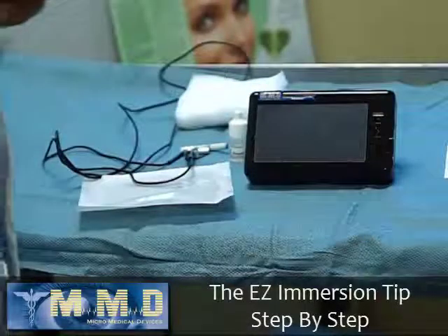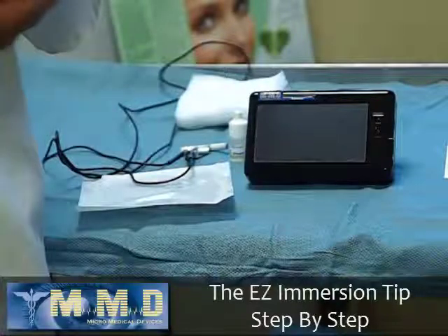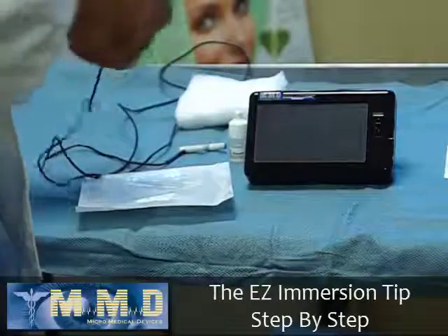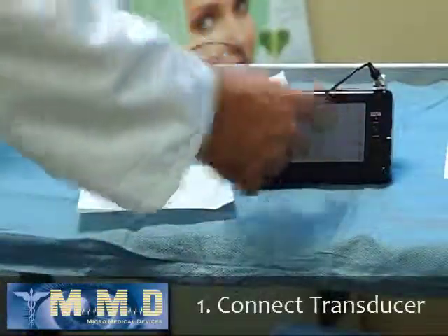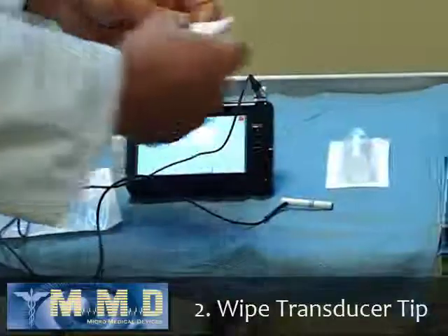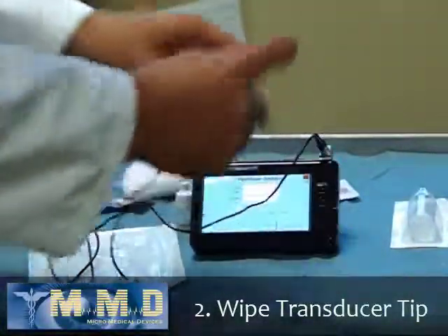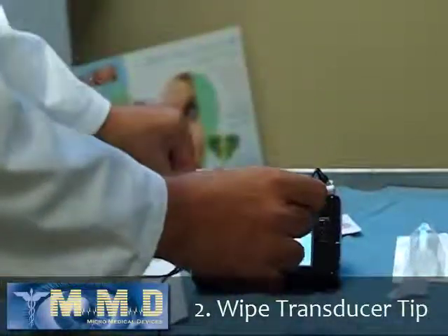Now I would like to go step by step and talk about exactly how I usually use the EZ Immersion Tip with great success. The first thing you want to do is connect the transducer to the machine and make sure that the PalmScan turns on. The transducer tip should be wiped out with the alcohol swab, even though it really doesn't come in contact with patients, but I still wipe it and then dry it.